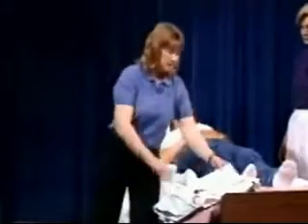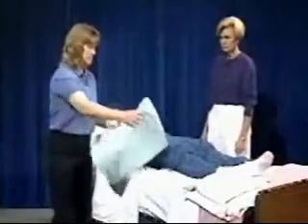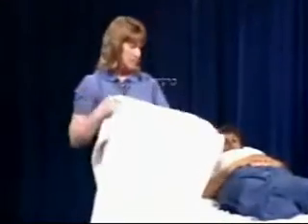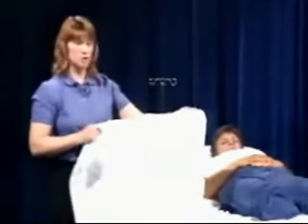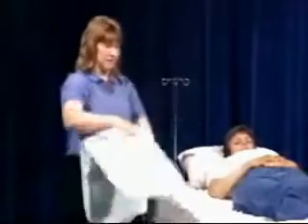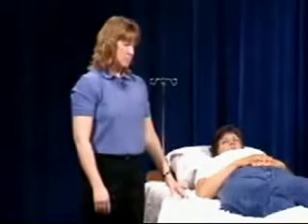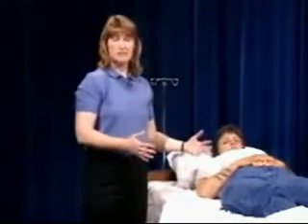Now, just so that you're aware, sometimes these patients, if they're incontinent and they tend to soil or wet the bed, may have what's called an incontinence pad underneath them. Because it's positioned in about the same place, sometimes this is used as the draw sheet as well. So be aware of that. This is an easy way to move a patient and position them, so don't forget that when you do this type of movement, get the assist of another caregiver so that you're not injuring yourself.